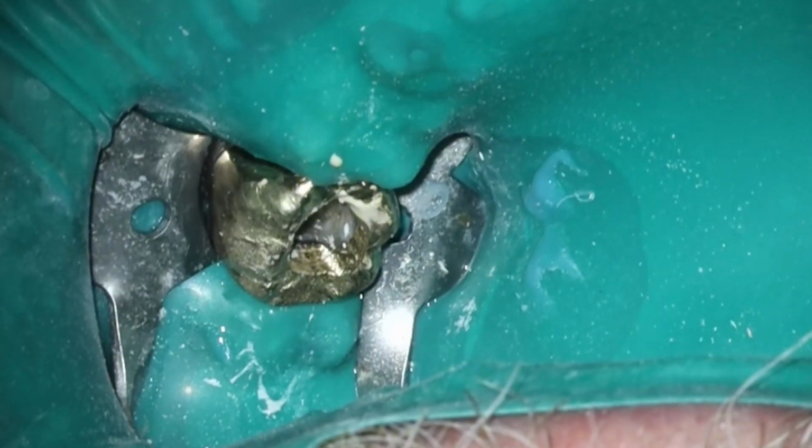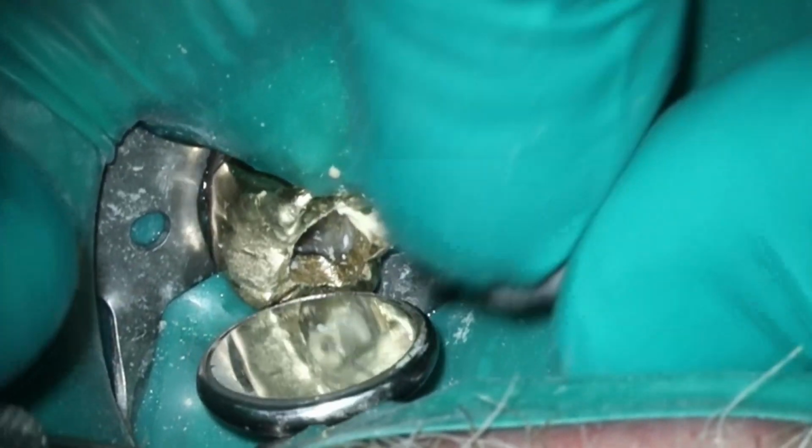And so that's what I was feeling for there, because once again, it's okay if this fill is a little bit short on a tooth like this because it didn't need a root canal in the first place because it's vital. So I'm okay doing a short fill if it's a millimeter or two. This one ended up being great all the way to the apex.